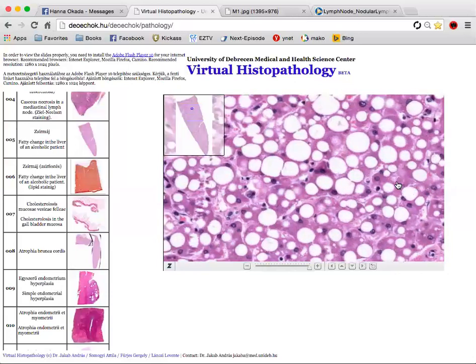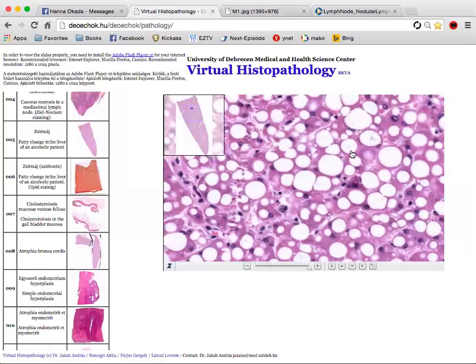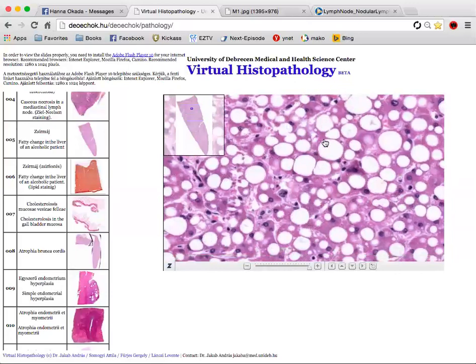So they might ask you a little bit about this topic if you get this slide. Just know that there's overproduction of triacylglycerol, okay, because there's more anaerobic processing of carbohydrates, and this will lead to accumulation of fatty acids inside these hepatocytes.